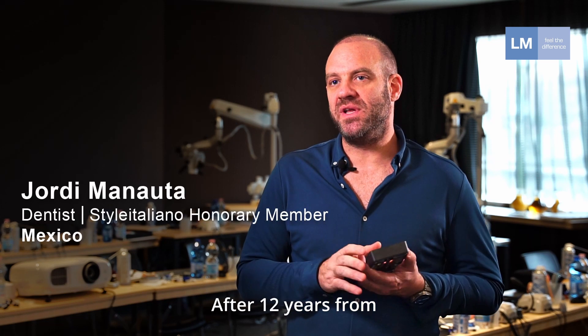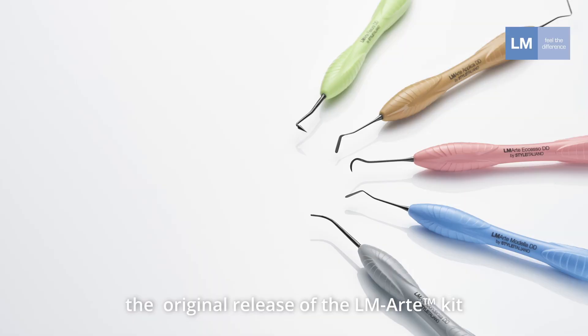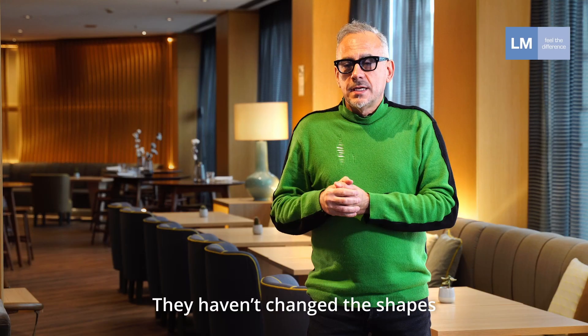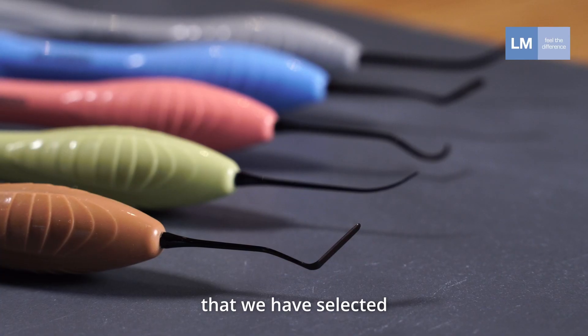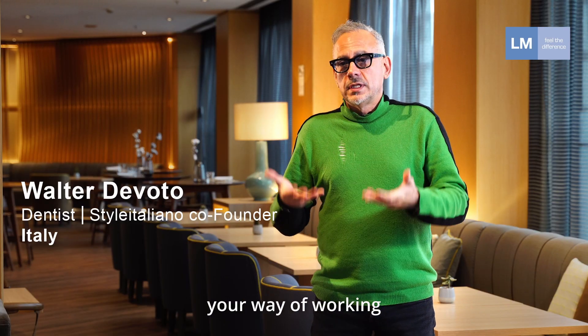Finally, after 12 years from the release of the original LM Arte kit, we are receiving the same kit with the dark diamond coating. They haven't changed the shapes that we have selected, so you don't have to change your habits if you already have your instruments.